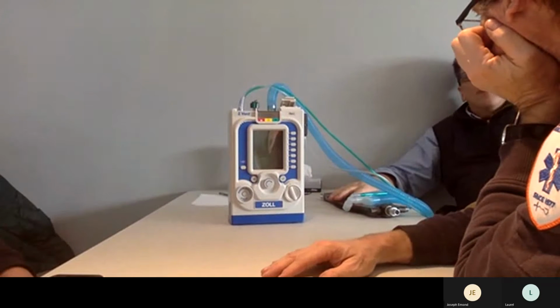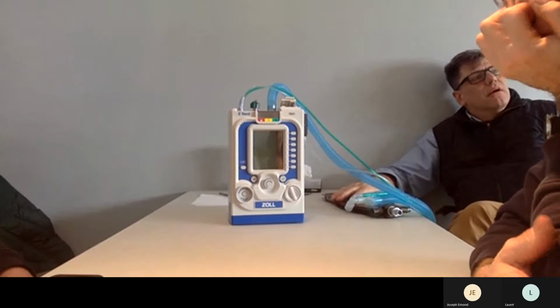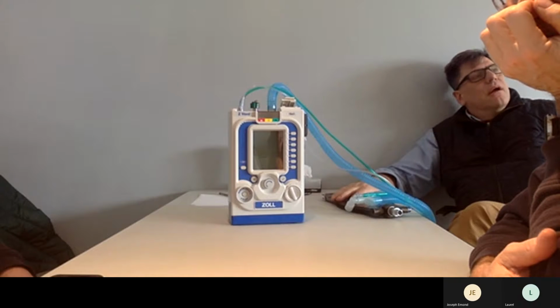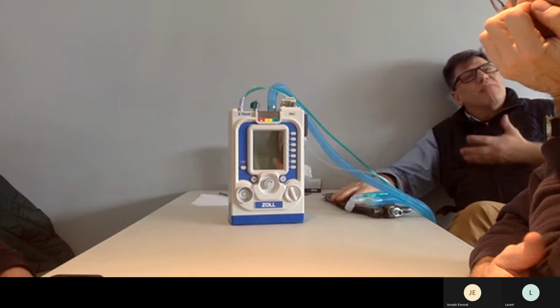Let's take this to the next step. What does CPAP stand for? Continuous positive airway pressure. Yeah, fabulous. What does PEEP stand for? Positive end expiratory pressure. Good. It's the baseline bottom pressure.